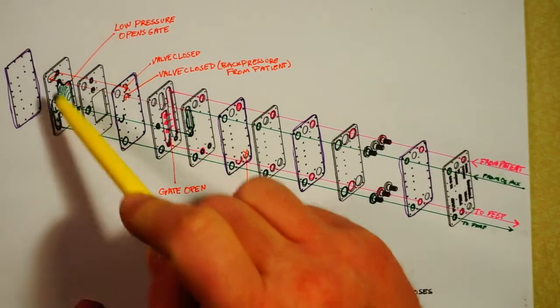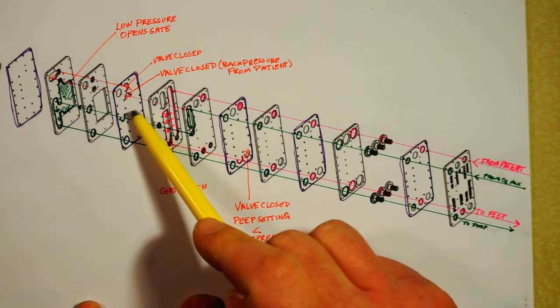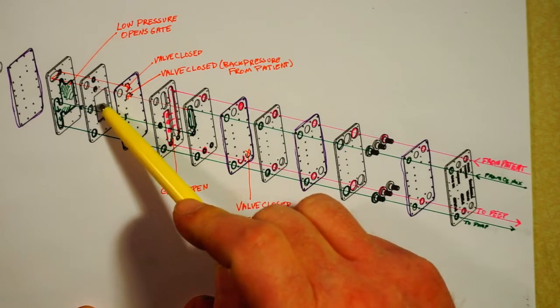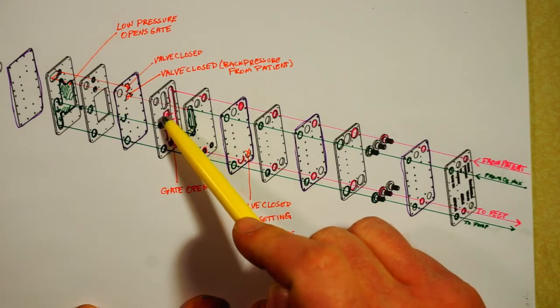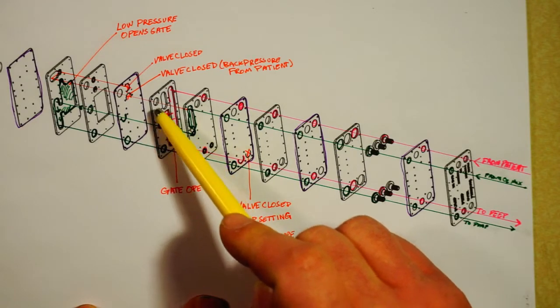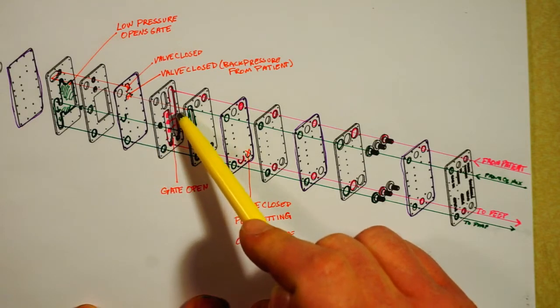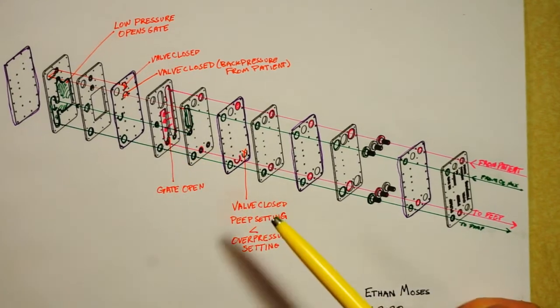Again, over here we have a vacuum or low pressure pulling this membrane up into this chamber and exposing the patient pressure chamber to the PEEP chamber, right? So air can flow around from the patient pressure into the PEEP pressure.